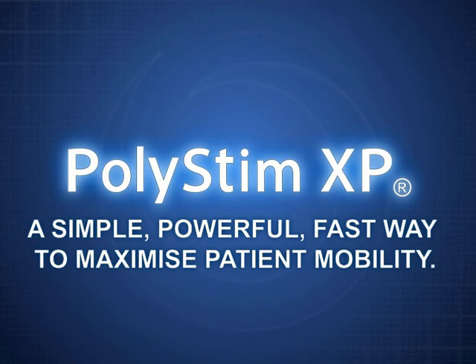When it comes to treating weakened or atrophied muscles or simply maintaining general muscle health, Polystim XP is a simple, powerful, fast way to maximise patient mobility.